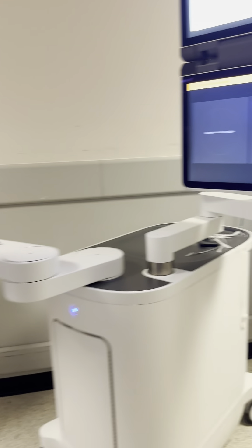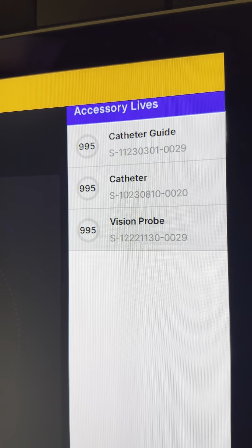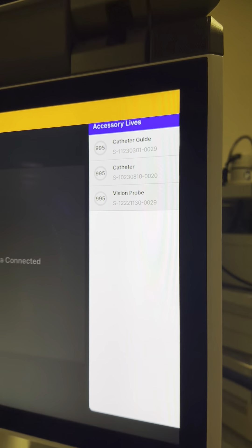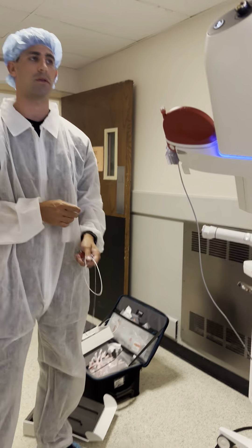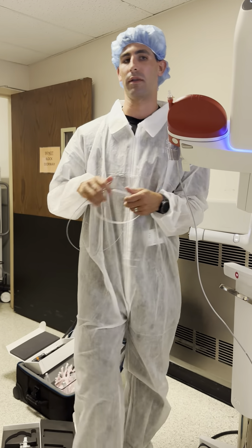You'll see the lives actually on the right side of the screen here. Those for demo purposes are rather large — yours will be singular numbers. When an item is expired, that number will be an orange circle and says EXP. If it is expired, make sure to tag it so we let everybody know and we keep the par levels the same.